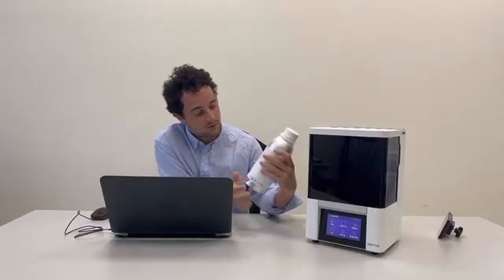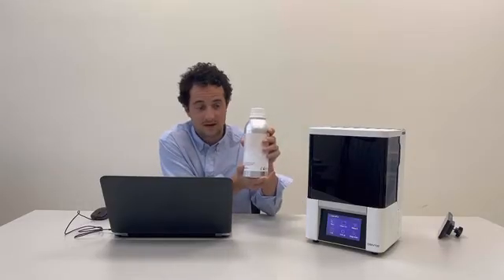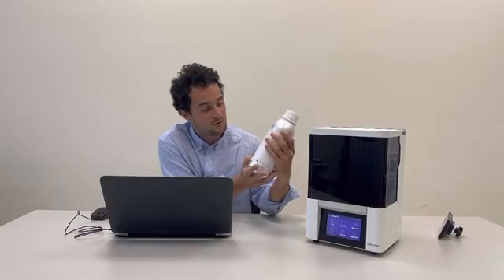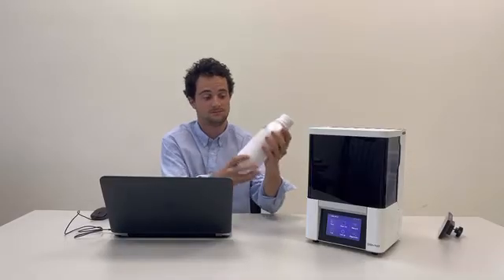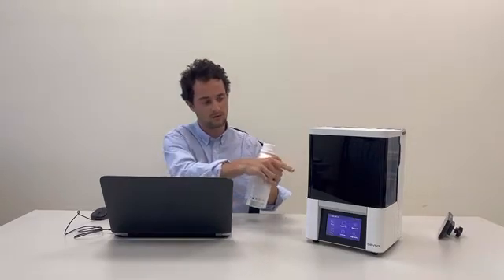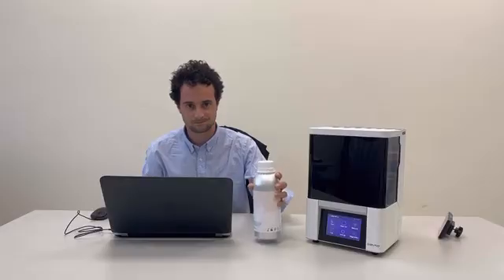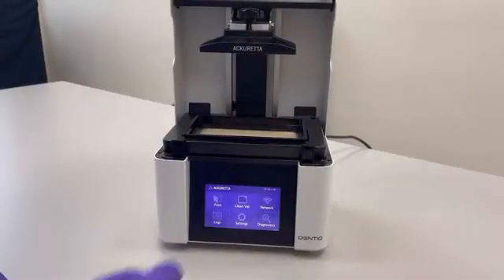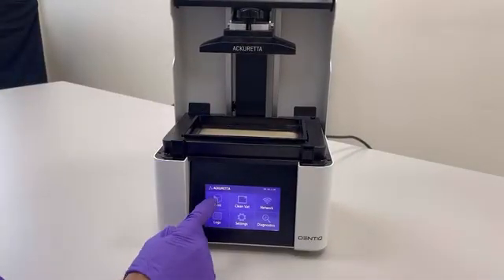Since it's a crowns and bridge application, we use Kuro Temp A2. Like last time, we'll have to shake it. You can shake it for one minute at least. After, when it's done, you can pour the resin inside the vat.